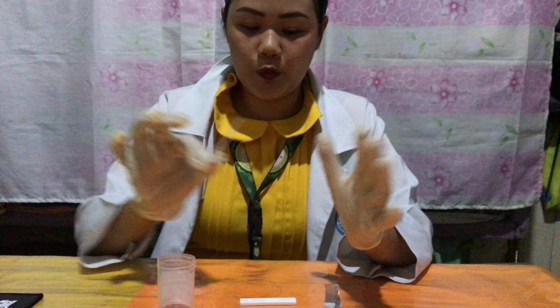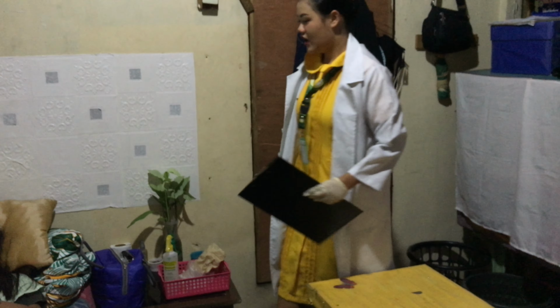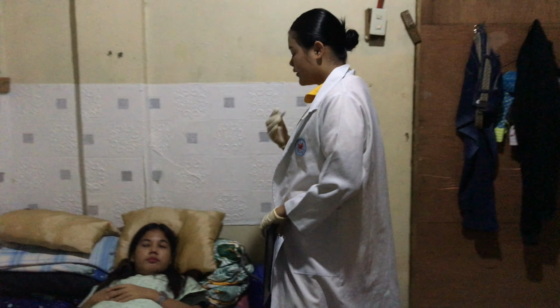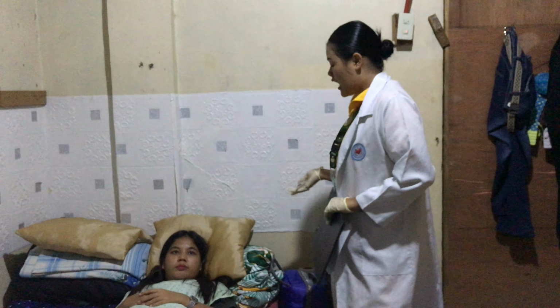So it is negative, because we only see one line. After doing this, we should get back to the patient and explain the results. Okay, Mrs. Domingo, your pregnancy test results came back. It turned out to be negative. If you have questions, kindly feel free to ask me. And if you want to confirm, you should have a confirmatory result on our ultrasound.